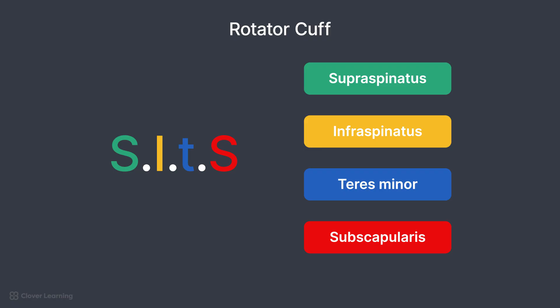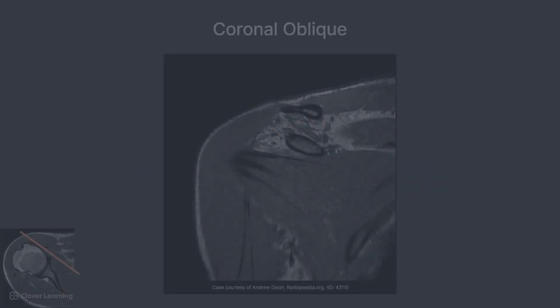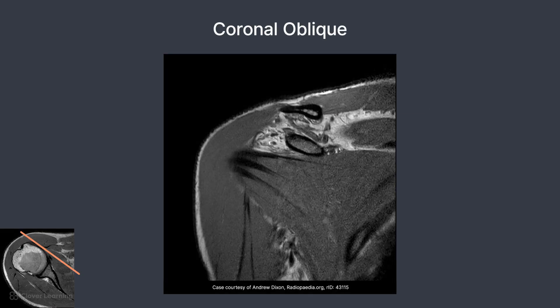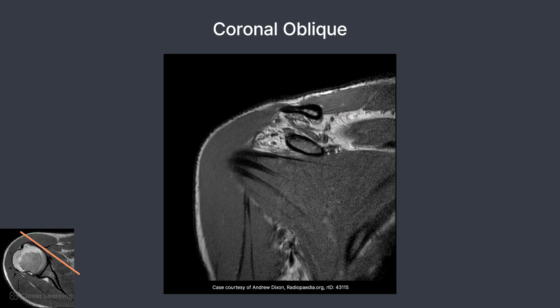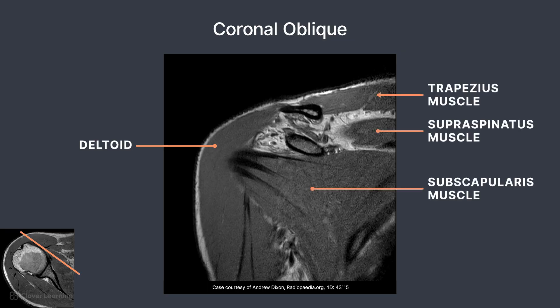Let's take a look at the anatomy on some MRI images starting with the coronal oblique plane. Starting at an anterior slice, important bony structures include the clavicle, located superiorly, and the coracoid process, demonstrated more inferiorly. There are several important muscles seen on this slice, including the deltoid on the lateral aspect of the shoulder. Other muscles from superior to inferior include the trapezius, supraspinatus, and subscapularis. A portion of the subscapularis tendon can also be identified, as tendons always appear as dark or black structures.